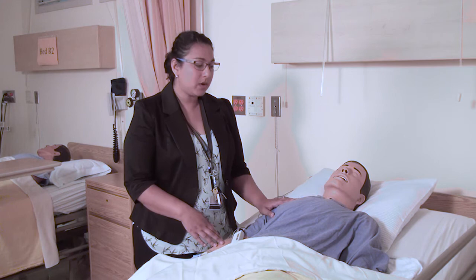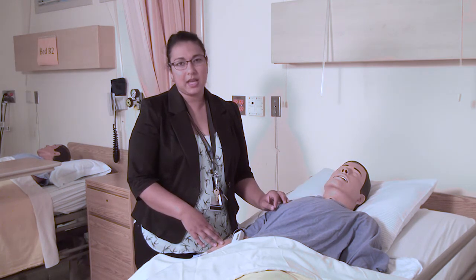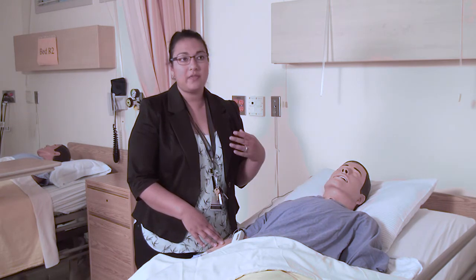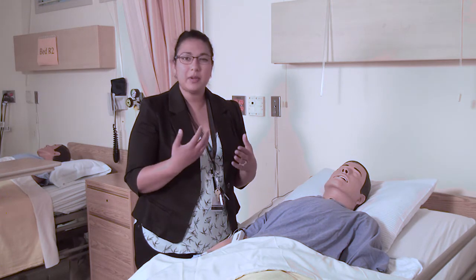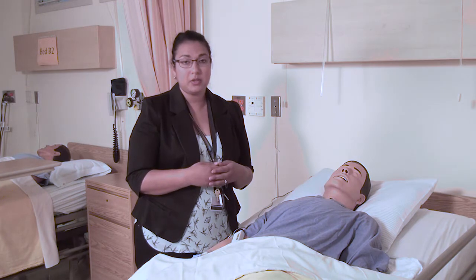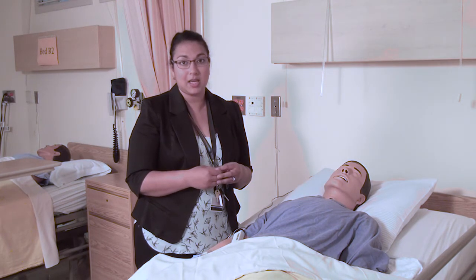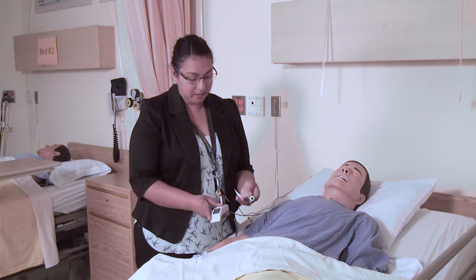And then you also want to make sure, we talked about goods and demands, so we want to make sure that they have a good understanding about how the pump works. So if they have a lot of demands, then that's a bit of a red flag to figure out, do they understand the pump? Do they understand that it's monitored, how much medication they can get at a time? So with understanding the pump, it's really important to make sure that you give them a button.